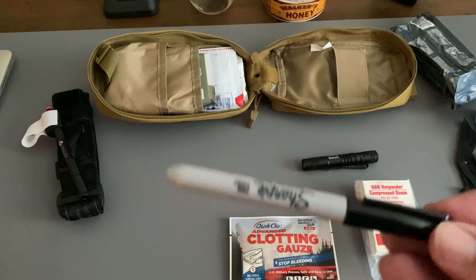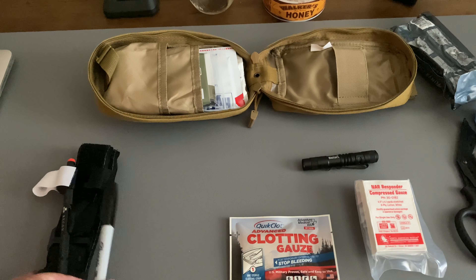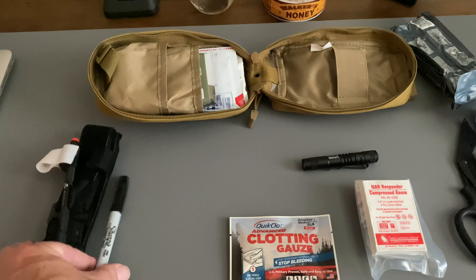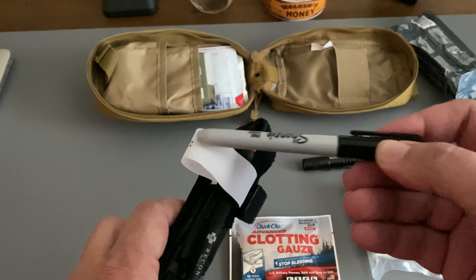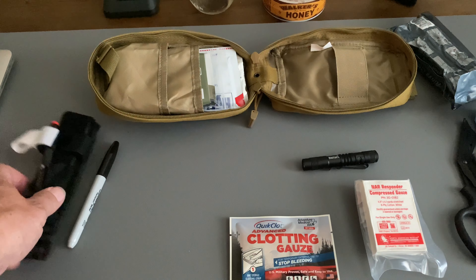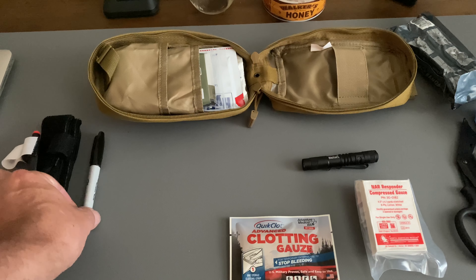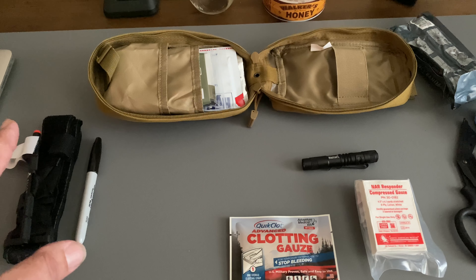We also have a Sharpie. The Sharpie goes along with the tourniquet — because once you apply that tourniquet, you're going to want to write on it when you put it on, so when first responders or whoever shows up, they know what time that tourniquet was applied.